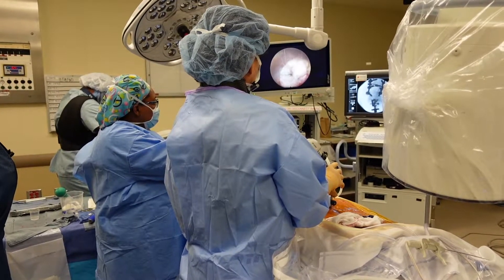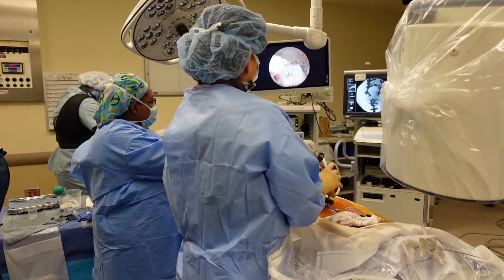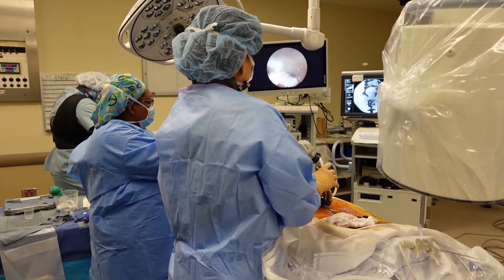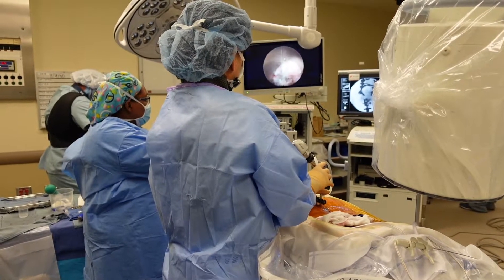This is why I use the blue dye — look at that, it's like coloring by numbers. That's why I still use the dye: it's pretty, and let's face it, I use every possible advantage that I could possibly have. You can tell it's scarred in though.